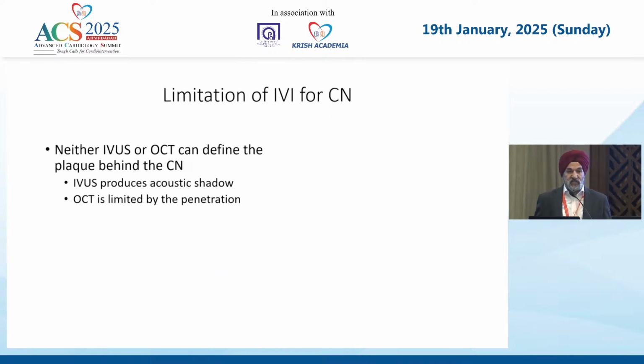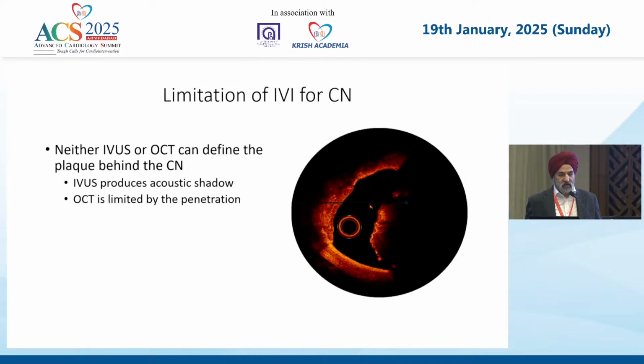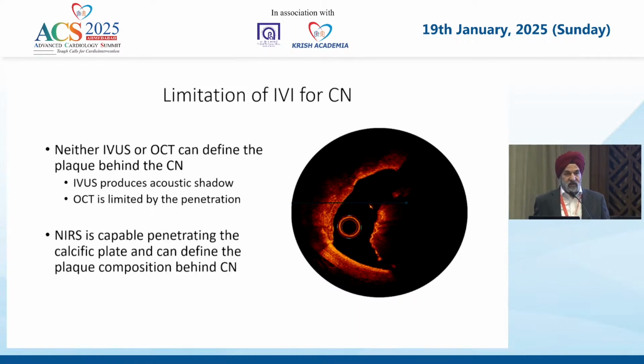Well, the limitation of the IVUS and the OCT is that IVUS produces a kind of acoustic shadow, and beyond that you can see nothing. And unfortunately, even OCT produces a negative shadow. OCT otherwise in a calcific plaque goes around the vessel. It can give you the thickness of the plaque, but in a nodule the segment is so thick that it also creates a kind of negative shadow, and you can see nothing beyond it. So the OCT is also not very helpful.